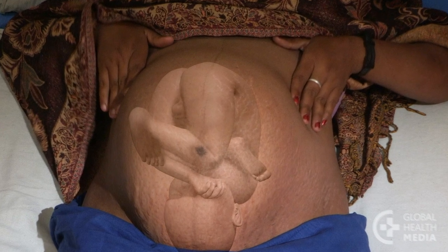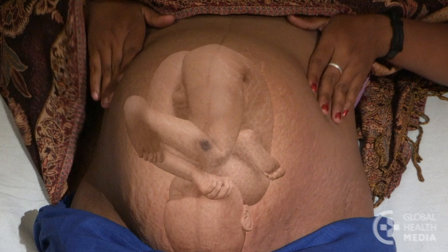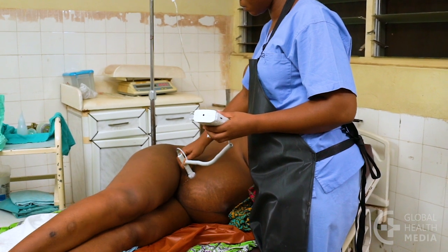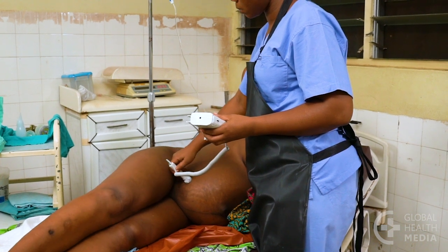If the baby is facing the woman's front, the heartbeat is harder to find because the baby's arms and legs get in the way. Listen near either side of the woman's belly or directly in the middle. As labor progresses, the location of the baby's heart gradually gets lower in the abdomen.